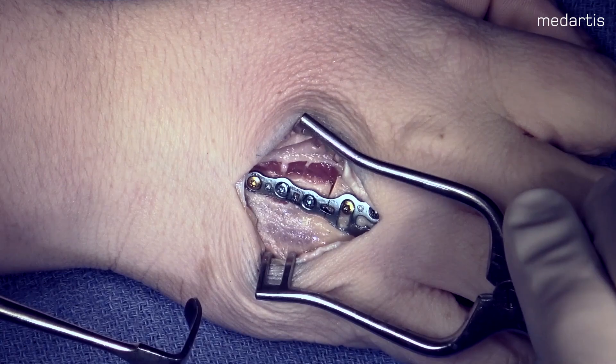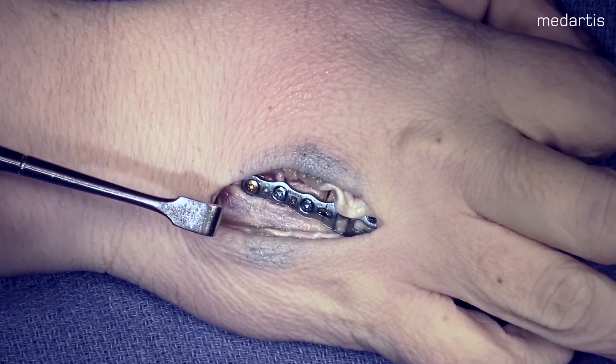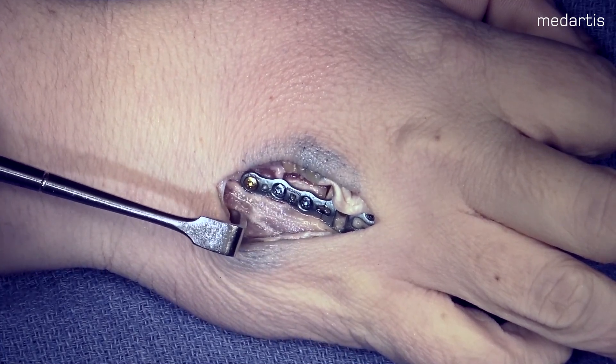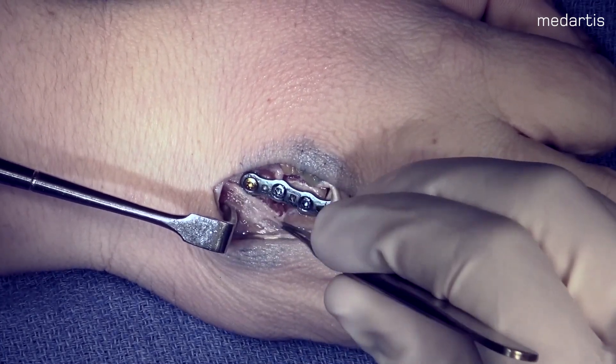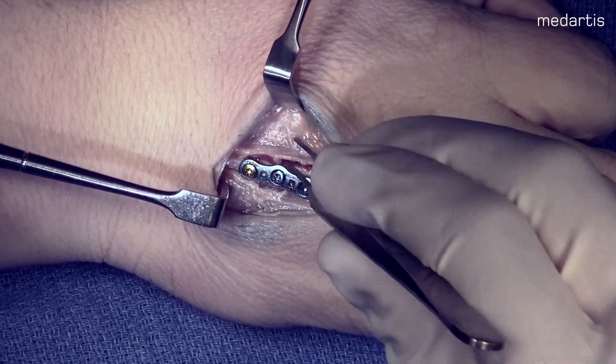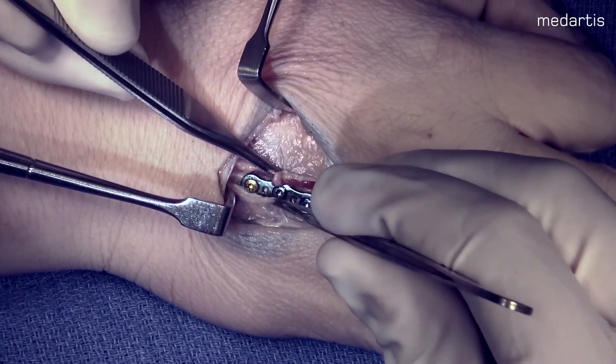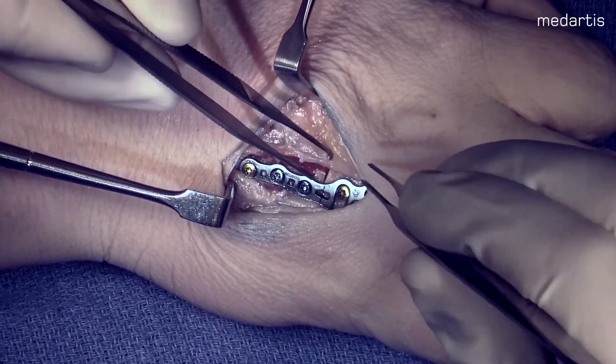Chapter 3: Closure and Post-Operative Protocol. After completing your fixation, I generally use 2-O Vicryl to cover the plate with the periosteum. Then the skin is closed with 3-O and 4-O Monocryl. The patient is placed in a splint, brought back to clinic at one week, and begins motion with the occupational therapist.